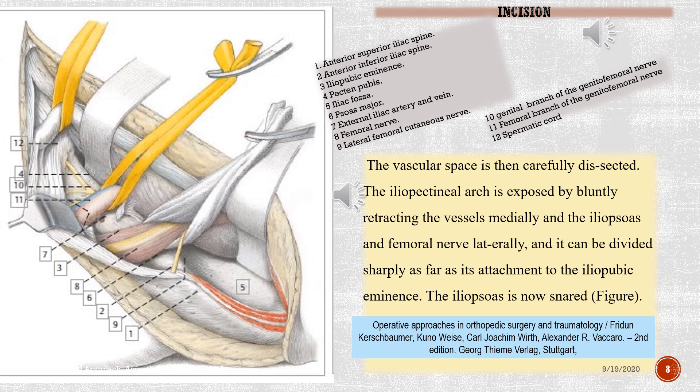The vascular space is then carefully dissected. The iliopectineal arch is exposed by bluntly retracting the vessels medially and the iliopsoas and femoral nerve laterally, and it can be divided sharply as far as its attachment to the iliopubic eminence. The iliopsoas is now snared.